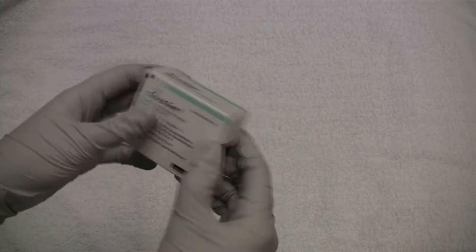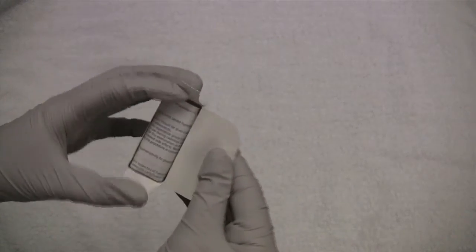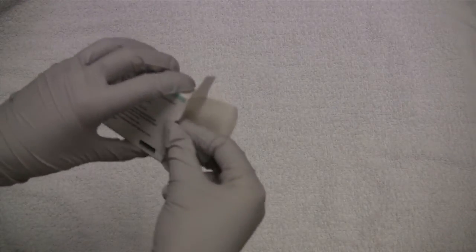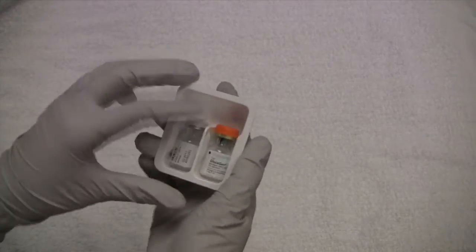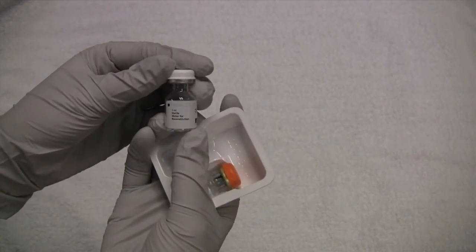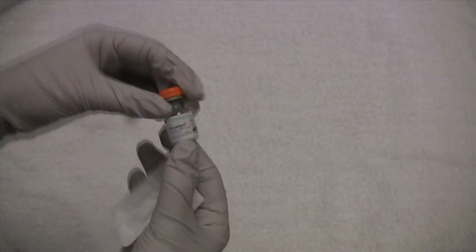So here is our glucagon, we can go ahead and open it up. It comes with an instruction booklet, which you can read at a later date if you really want to. We pull out two small vials. The white vial is 1 mL of sterile water, and the orange vial is our actual powdered medication.